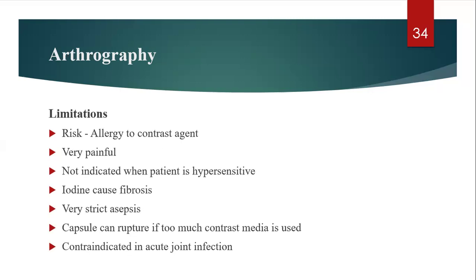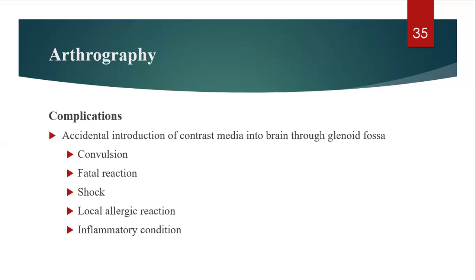But the limitations of arthrography include, as iodine-based agents are used, there is a risk of allergy to the contrast media, and the injection technique is a bit painful. Also, it is not indicated when the patient is hypersensitive. And in some cases, it can cause fibrosis. While performing arthrography, a very strict aseptic procedure should be used, and it is also contraindicated in case of acute joint infection.